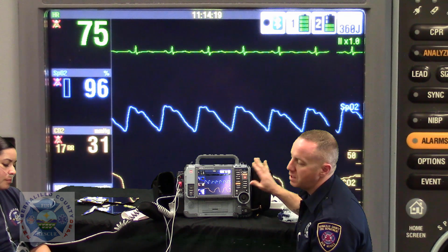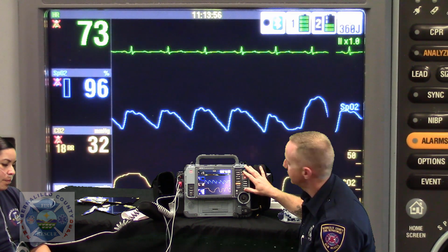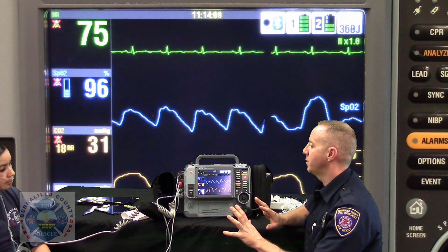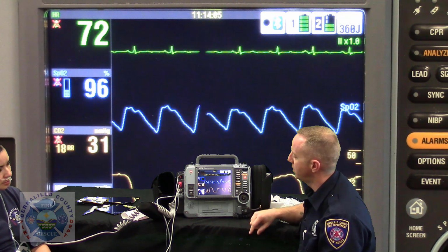We made patient contact and powered on the monitor when we did that, so later we know when we actually made physical patient contact. We've deployed all of our vital sign gathering equipment and gotten a complete set of vital signs, which have timestamped when those were obtained.